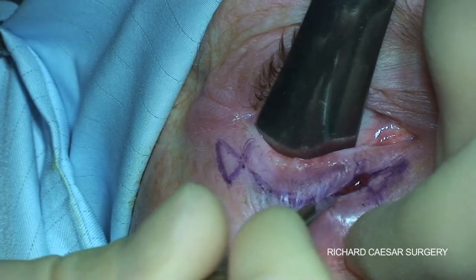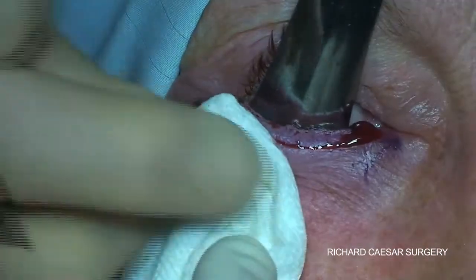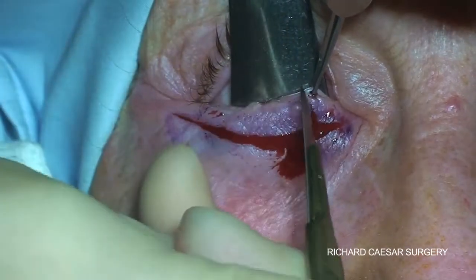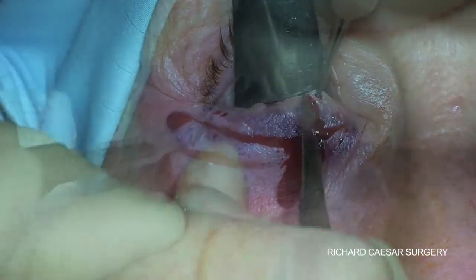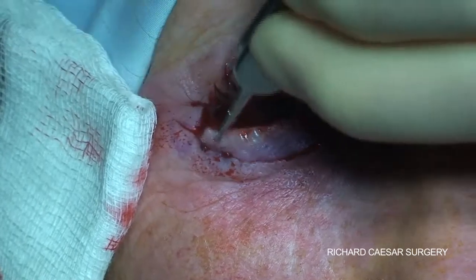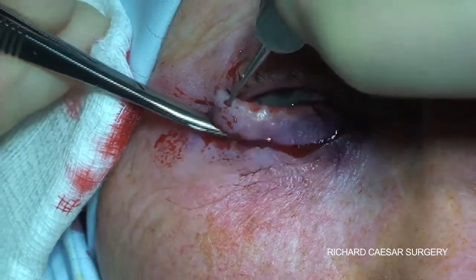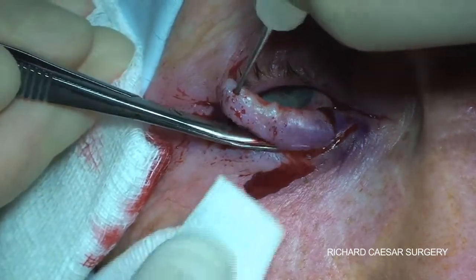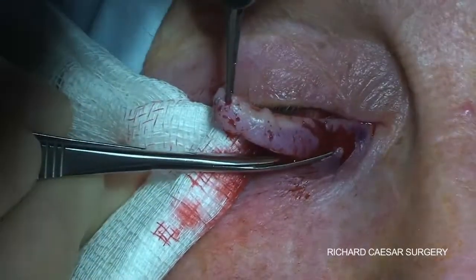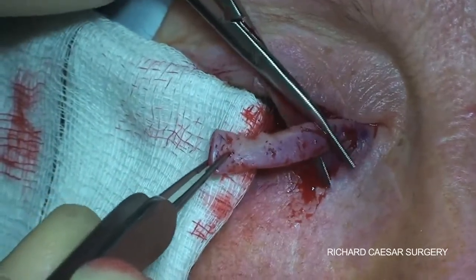The next step is to excise the lesion, and I still prefer cold steel to anything else. At one point I was keen to use the cutting cautery, but I found that for excisions where previously there would be no confusion from the pathologist and I'd be getting clear margins, use of cutting cautery tended to cause a slight contraction of the collagen. I was having unexpected results back from the histopathologists such that for lesions where I thought I'd had a very clear margin, the results were coming back that the lesion was close to the edge, and yet subsequent further excision had a very low harvest. I therefore now use straightforward scalpel and scissors for all excisions.